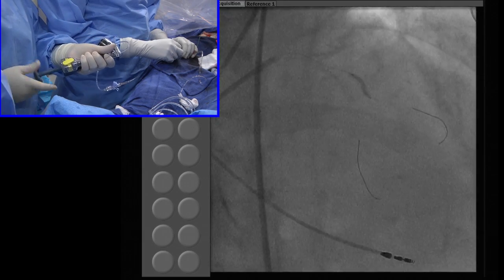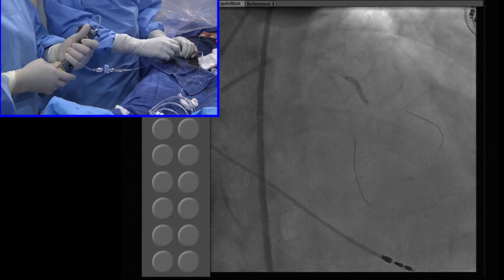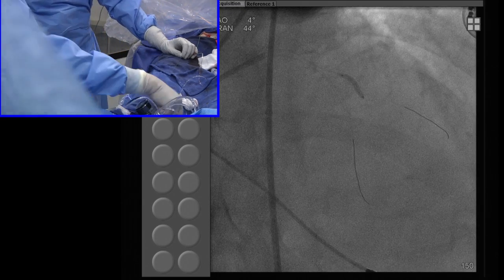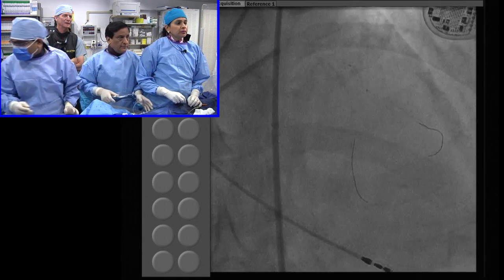Yes, particularly when you are overlapping, no? This is a whole technological issue to try. An 18 may come in up to the ostium, no? Use iodinated material to make it visible.